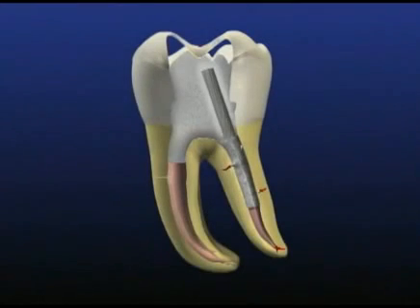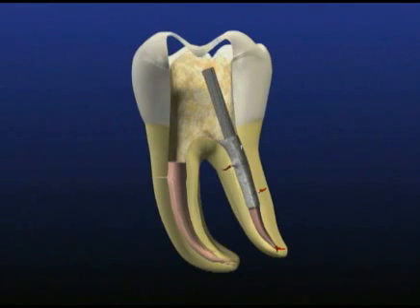An animated molar graphic demonstrates a mandibular molar with previous endodontic treatment. Note inadequate access, core material inside the pulp chamber, and a post. Rotary cutting burrs and abrasively coated ultrasonic instruments are used to fully expose the post.